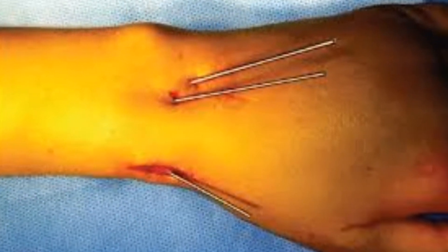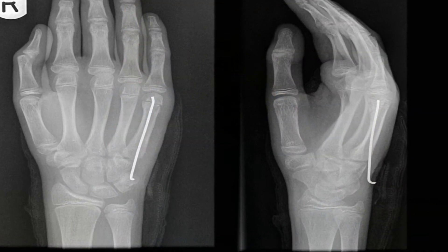What we have done is we have put forth and standardised the method of fixing fractures, especially hand fractures, foot fractures, shoulder fractures, and also some elbow fractures. We have described an exclusive method of fixing these complex small bone fractures — small bone long fractures in the hand and also in the wrist.